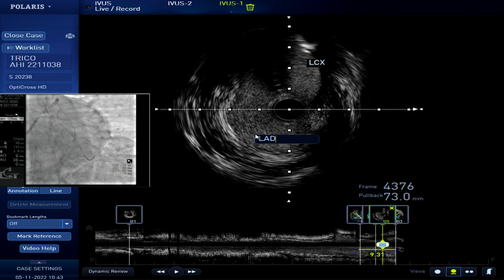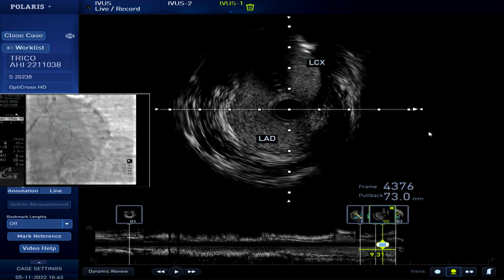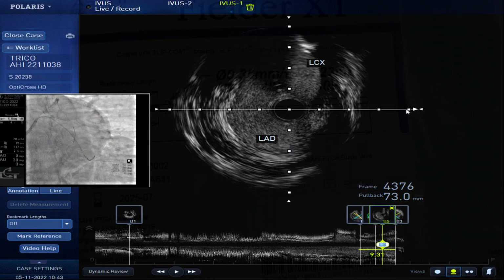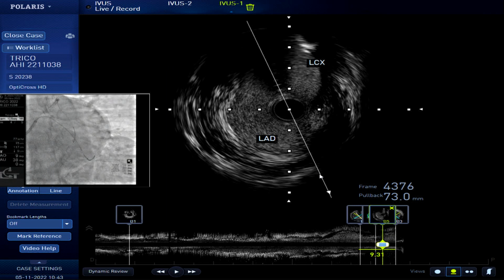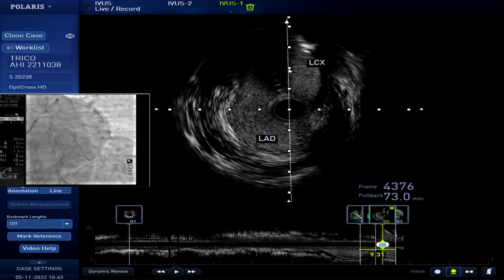Dr. Akasaka, will you like to comment something about carinal shift in case we are planning to go ahead for, say, ostial LAD stent instead of the crossover? Can you comment something about, say, branch point, carinal tip angle distance, and the angle as well? Yes, I try to check the angle, right? And meanwhile, have you now IVUS of the ostium of the LCX as well, when you do have a pullback from OM1 or OM2? Yes.